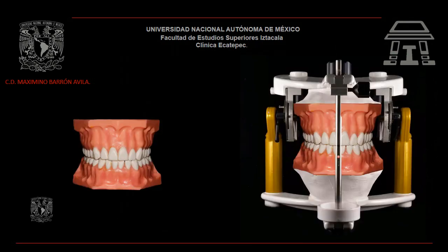Para nuestra práctica nos apoyaremos de un paciente simulado. Usaremos un tipodonto montado en un articulador semi-ajustable.